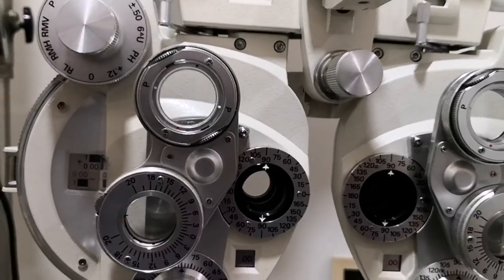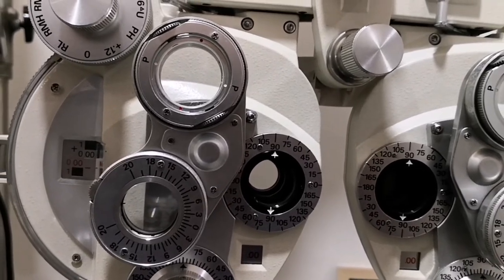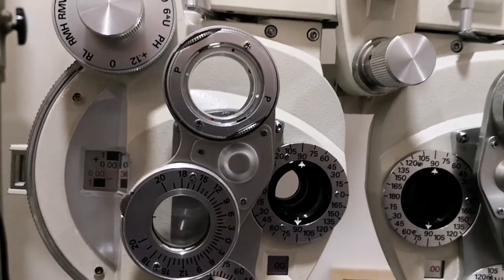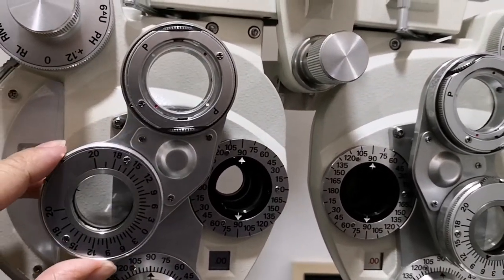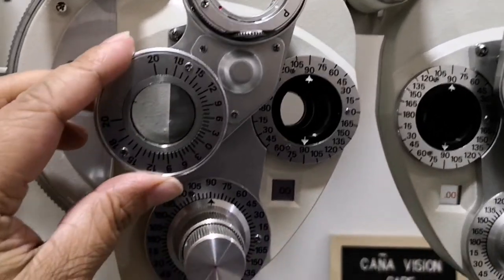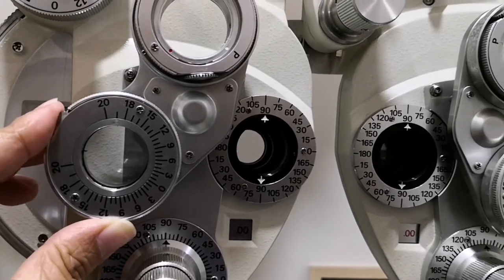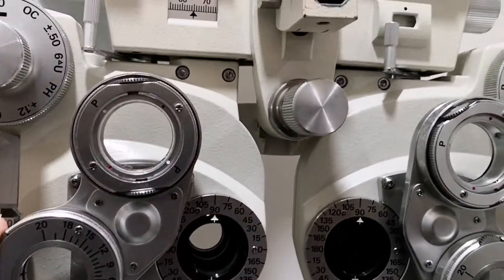Next, we have the ancillary unit. It is called ancillary because it is attached to the phoroptor. It is usually composed of two or three units that can be rotated in front of the eye. But for this phoroptor, we only have two. This is the rotary prism or the Risley prism. It has an indicator and a base.